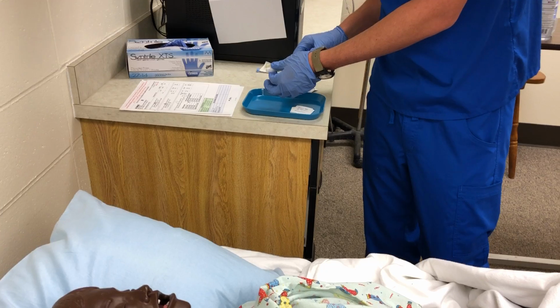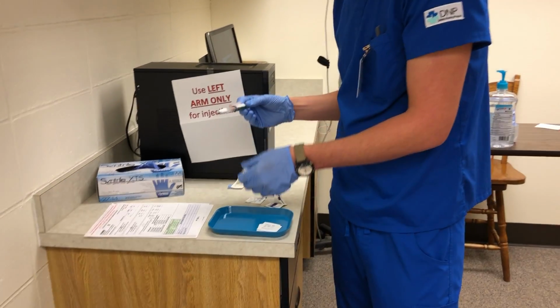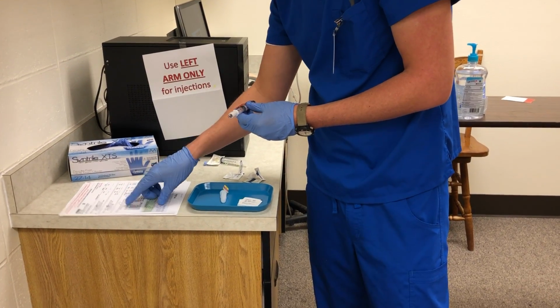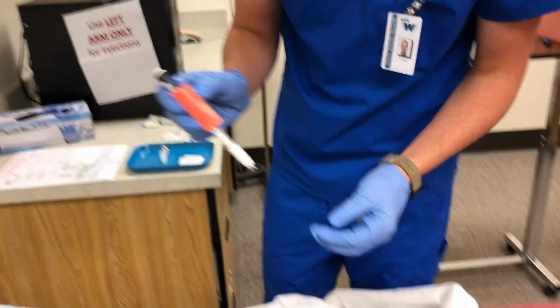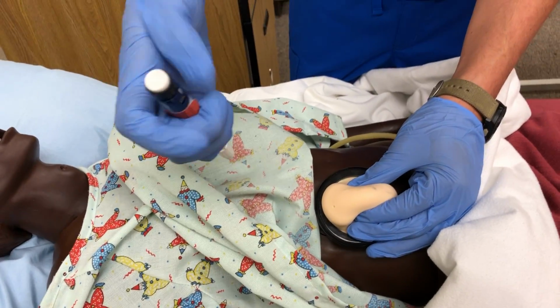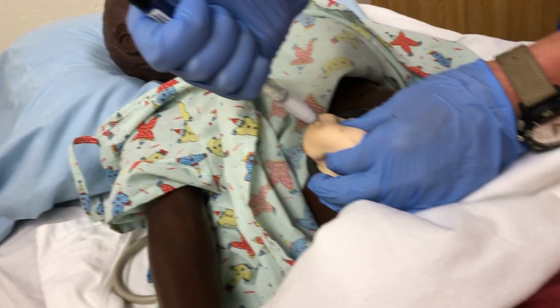And then we're just gonna uncap this. And again, I'm gonna verify I still got 2 because these can change. And this is the Lispro, and it's on my MAR at U100 for 2 units. Okay, so then we're gonna pinch, and we're gonna push down on it. Ready? Ready, Shirley? 1, 2, 3.